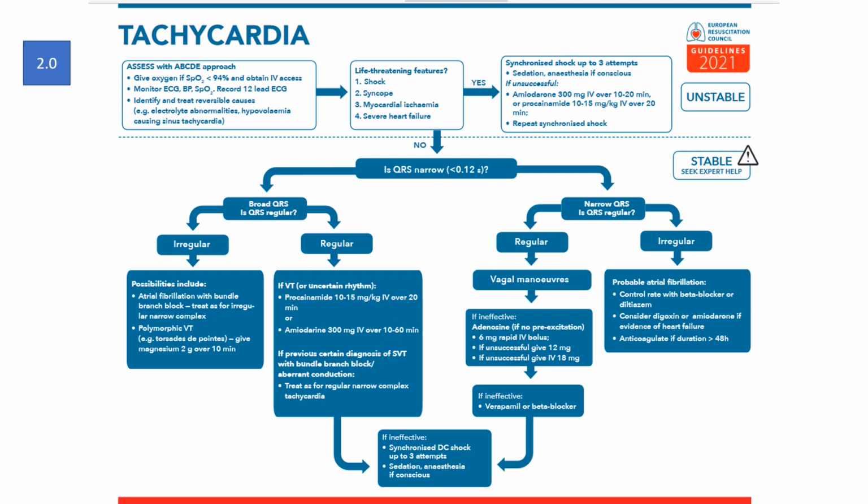So just saying, it seems like there's a bit of controversy in this area, and it's certainly something that is also controversial sometimes when we have these patients in our departments because of different opinions. And in general, I think the wise choice is to just have pads on your patient no matter what you do, so that you can give them a shock if you need to. And I think it's reasonable that we should not convert someone who's not anticoagulated unless they're unstable.